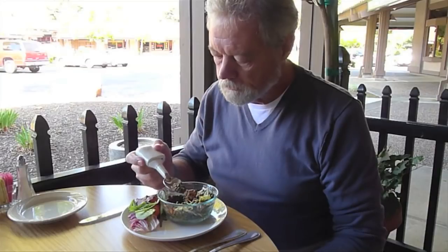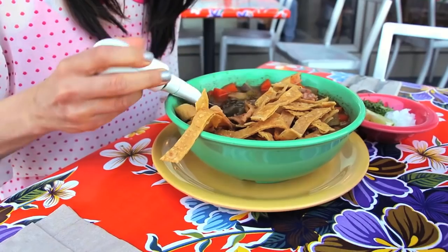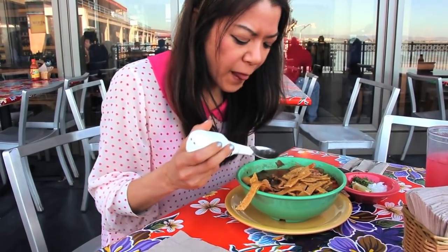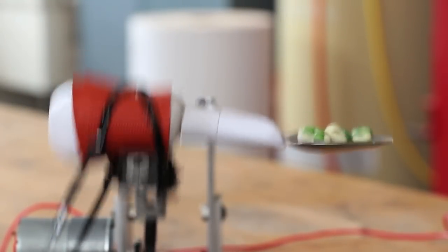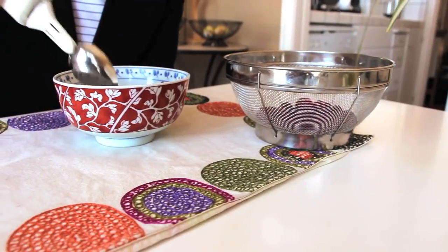We invented the Liftware spoon to cancel hand tremor and take the frustration out of eating. For the first time, we have the technology to actively stabilize a person's tremor in a device so small that it fits in your hand. The spoon works by sensing a person's tremor and intelligently stabilizing itself to make the food's journey from the plate to the mouth much easier. Liftware is designed to be part of your life.